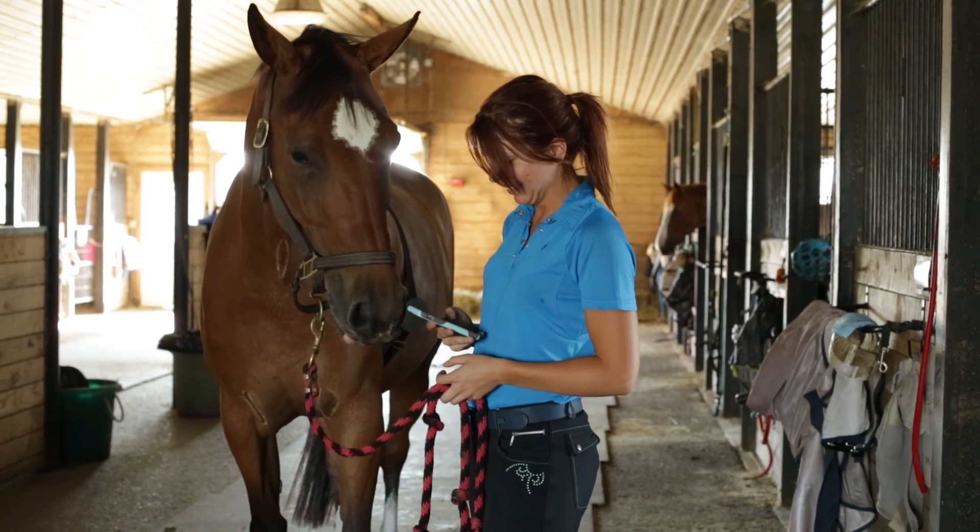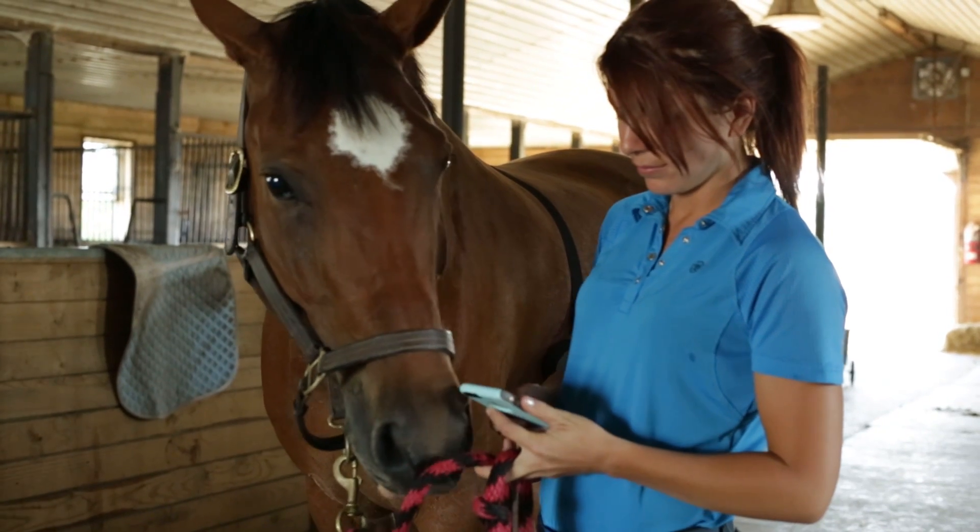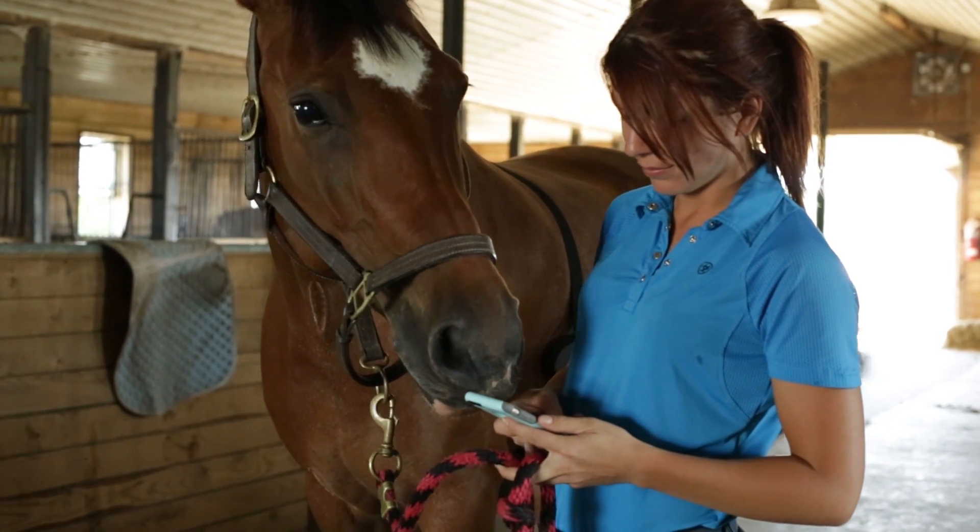Since Seahorse uses a patented collection of sensors to monitor respiration, it works best if the horse is stationary during the scan. And that's all there is to it.